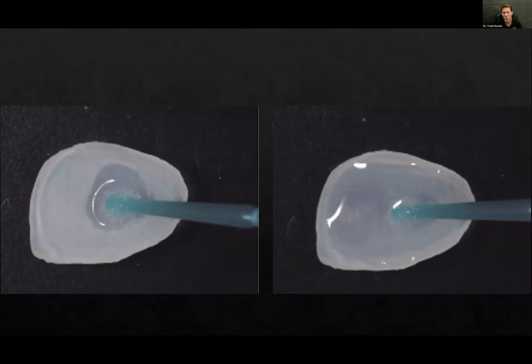Now, silanes are important because they allow us to couple, it's kind of an intermediary product, which allows us to bond an organic material to an inorganic material. So it allows you to bond the resin to the ceramic. Okay. So this is a necessary step that you have to have. Again, whether it's a two bottle system or a single bottle system, this is a step you must get right. Okay. All right.